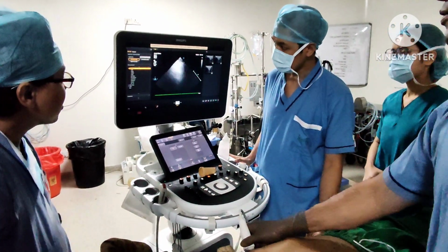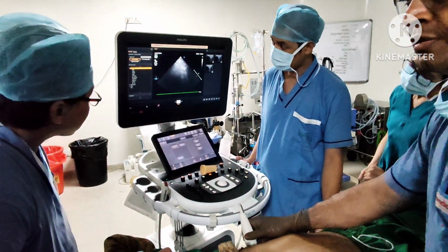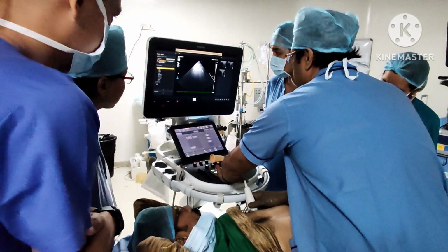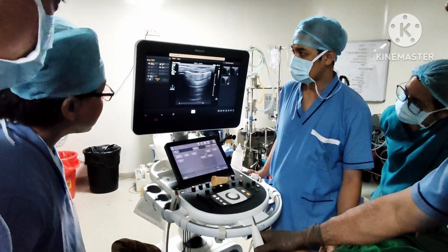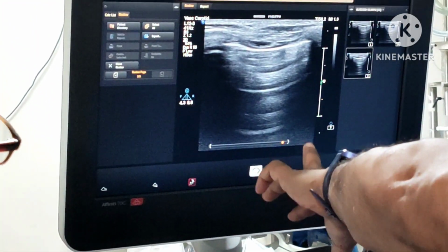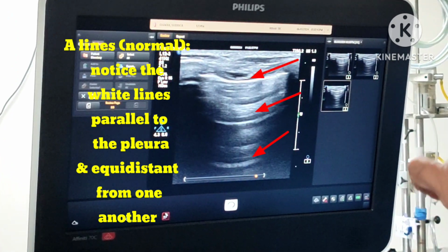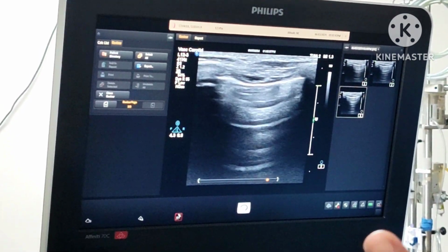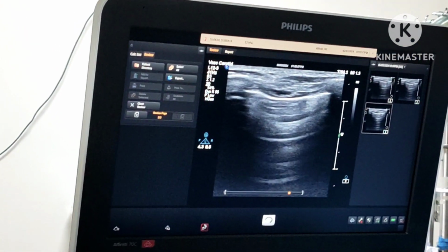Good. So in a normal lung ultrasound, you're basically looking for two things. First is the lung sliding that I've shown you before. Let's go over there once again, just to revise. You have a linear probe, and in this case the depth was probably 4 centimeters, so down 3 to 4 centimeters, and you have used a 12 frequency probe. You have the two ribs with the acoustic shadow, which is basically the bat wing pattern. And in between, you can see the normal lung sliding, the visceral pleura moving over the parietal pleura.